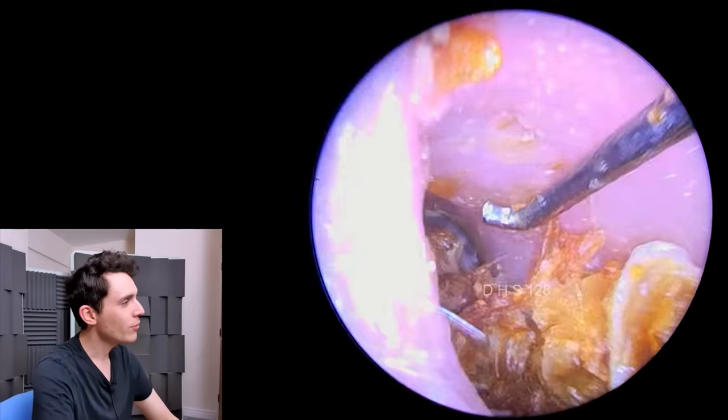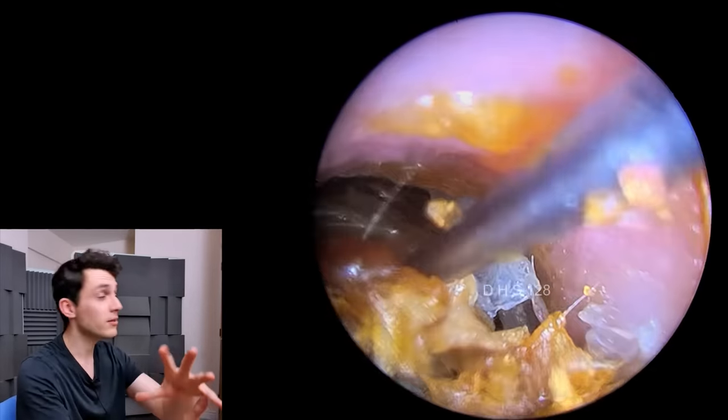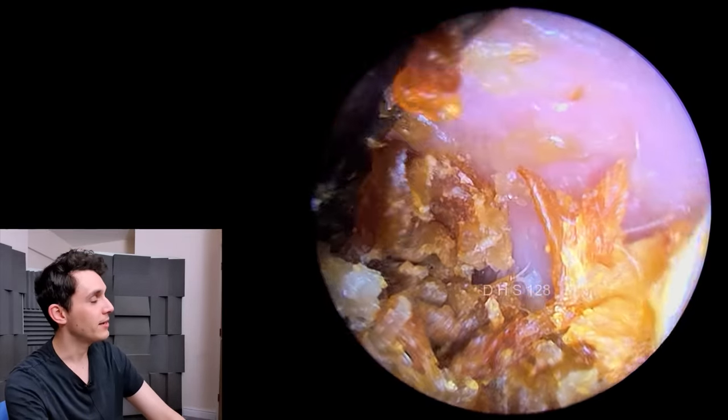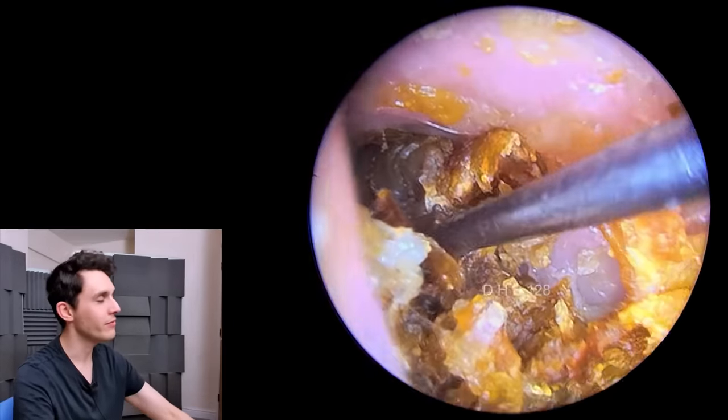I'm just dragging all these sheets of dead skin forwards. As you can see, as I drag it forwards, all of these sheets start to unravel. It's a bit like digging a lasagna out of someone's ear — or an onion. It just kind of fragments and fragments and unravels and unravels.